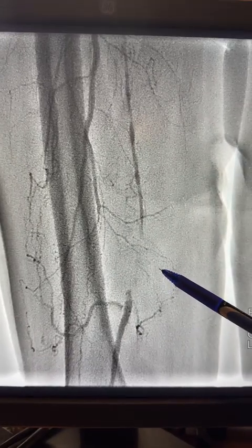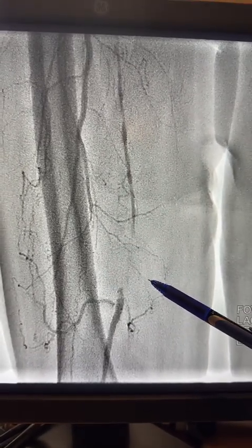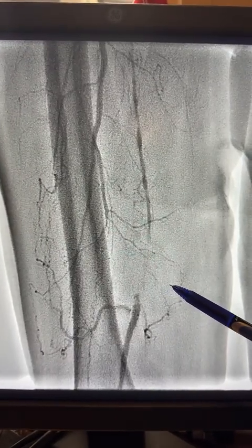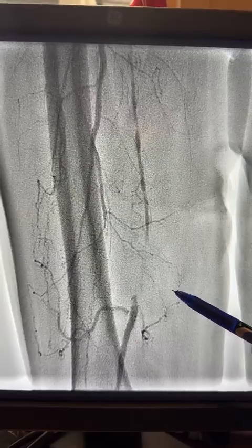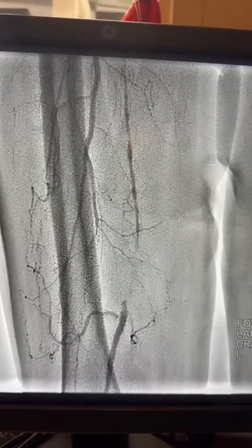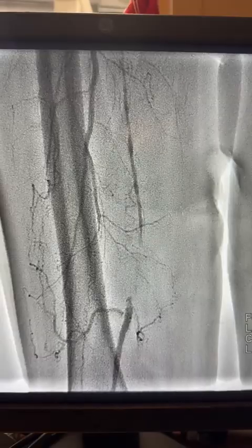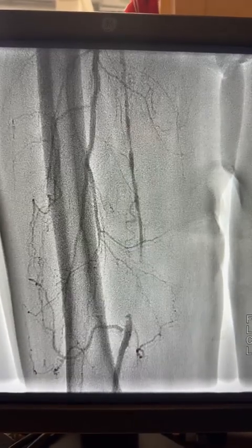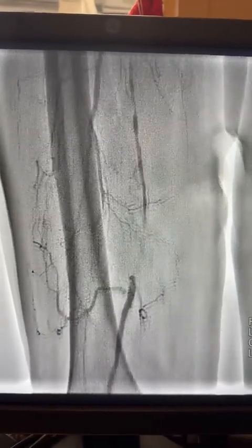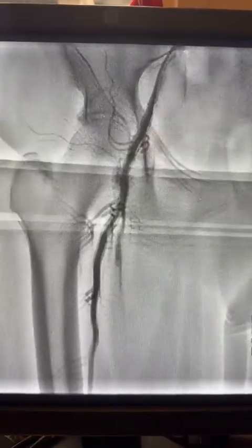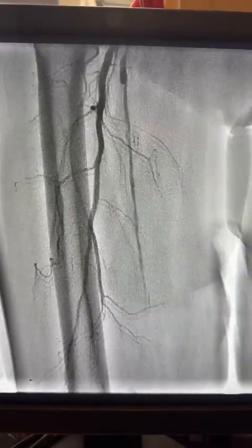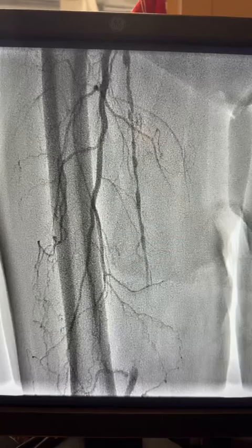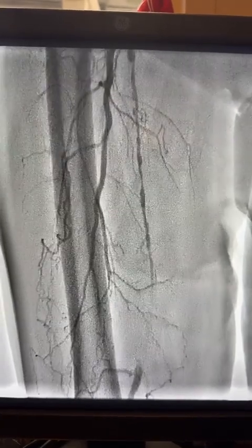Good evening. We have this CTO SFA — a 66-year-old female was referred to me for CTO recanalization, which was found during heart catheterization. Here is the angiogram. The patient has severe claudication symptoms on the right side. You can see the CTO — there is diffuse disease in the SFA starting approximately here.